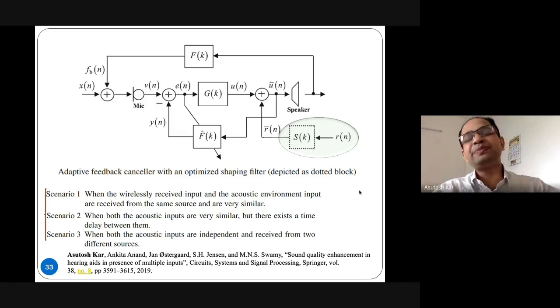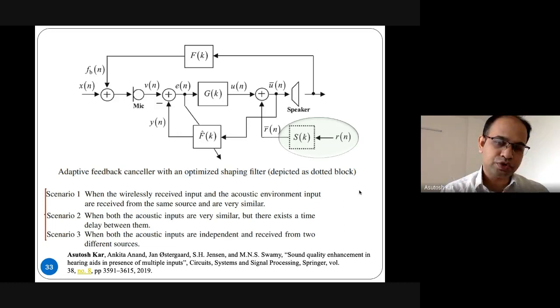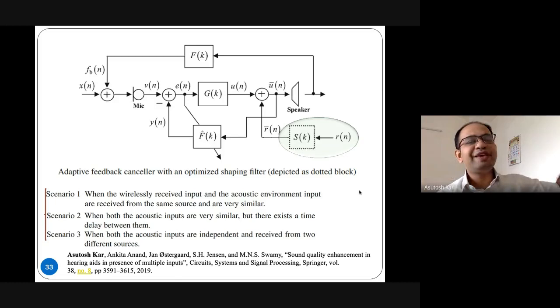But in the year 2017 in Denmark and now all over the world, advanced hearing aids have been introduced and it has come to India also. So there, what is the facility we get in an advanced hearing aid? The hearing aid has Bluetooth. So it can connect to any other device which has Bluetooth. For example, we have hearing aid enabled TVs in many of the abroad countries.